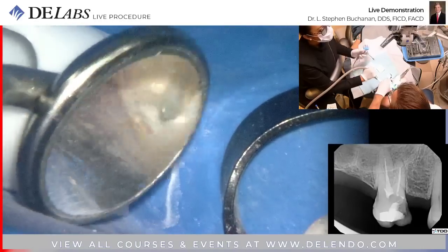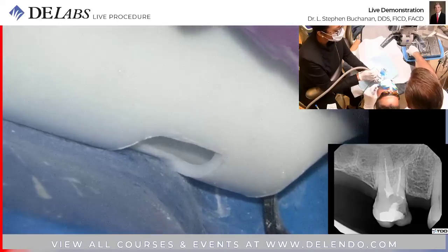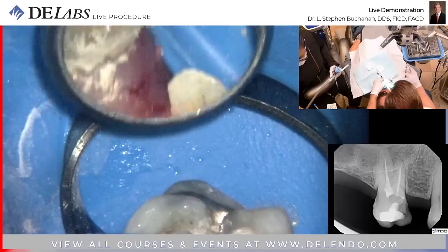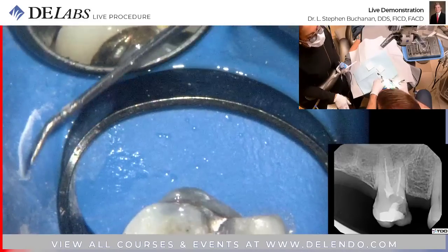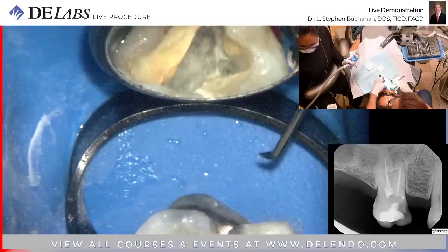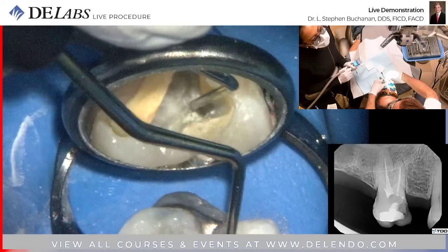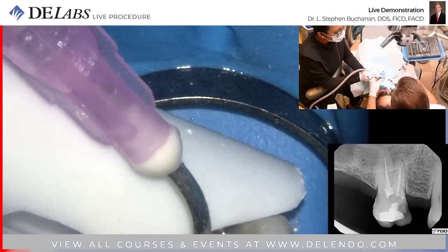I can control the LA diamond a little bit better. So when you have a bent DG16 explorer, on the near end that we use to go onto mesial canals, you're going to bend it towards the inside of the curvature. And on the other end, to go into the distal buckle, you have it bent the opposite way to fit underneath a pulp chamber roof as it comes in, if it's coming in at a serious angle. This one actually is coming in at a very nice angle. So a straight explorer would locate this guy better.